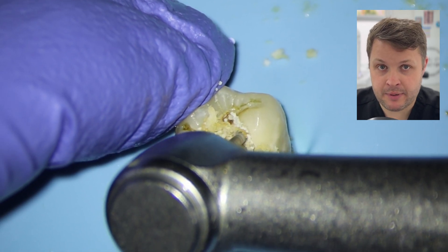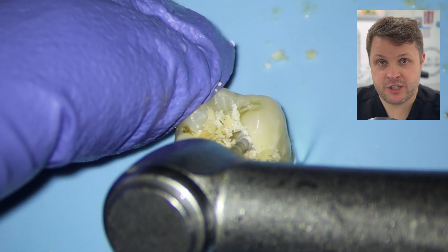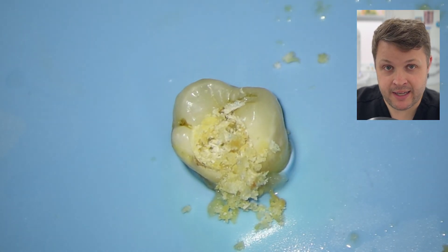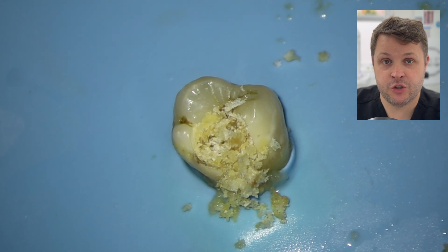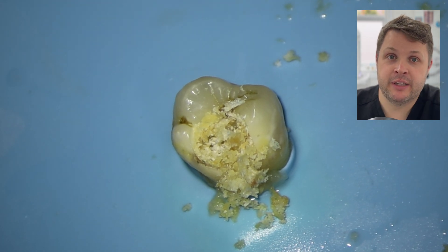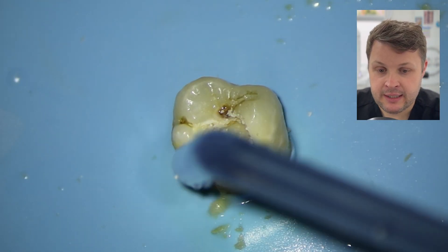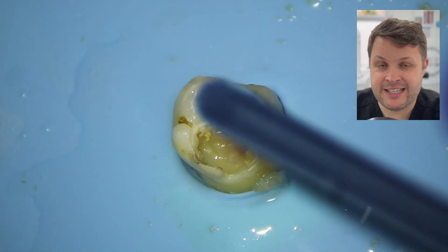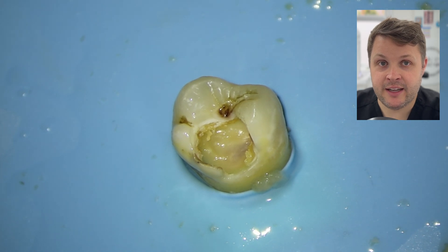If there's a small lip, then that's fine. But if there's a significant amount of dentin that's been undermined — like a sort of bridge of enamel — I'm going to take that bridge of enamel away with a fast handpiece. And as we sort of remove the dentin here, we can see there's the underlying pulp underneath.